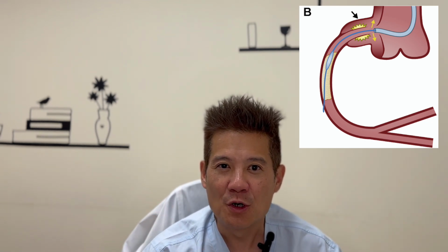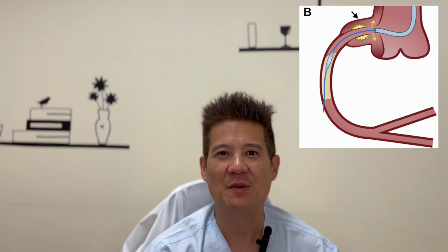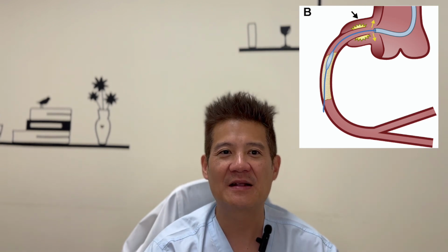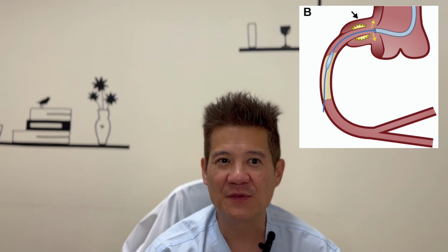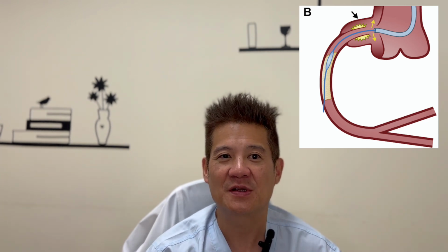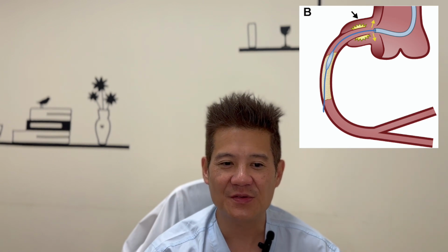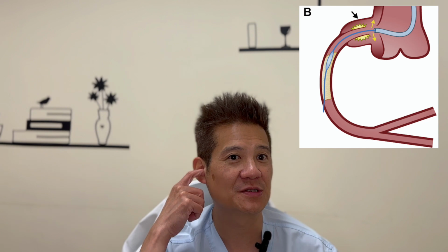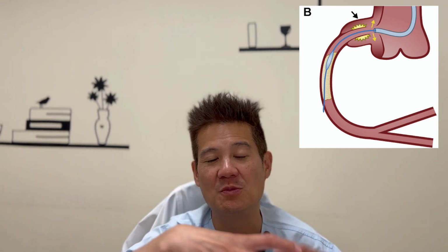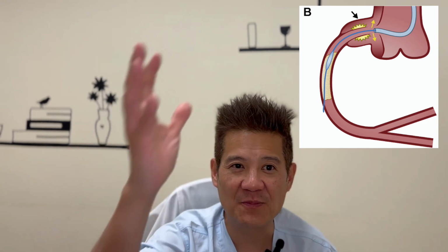So this is an urgent problem. This is a time-sensitive problem. You want to be able to stent and cover the entrance of the dissection as soon as possible. And often the culprit for this is the guide dissection. The guide has dissected the ostium of the vessel, and you've pressurized the ostium, and now there's a hematoma in the ostium of the vessel tracking up the aorta.